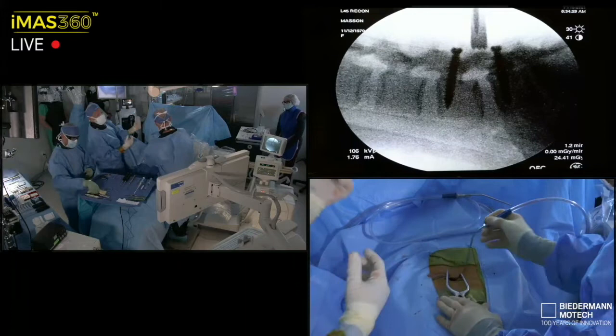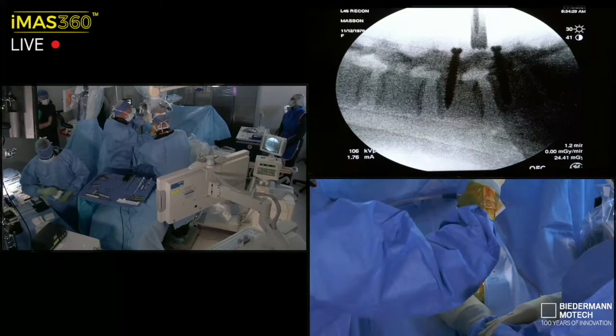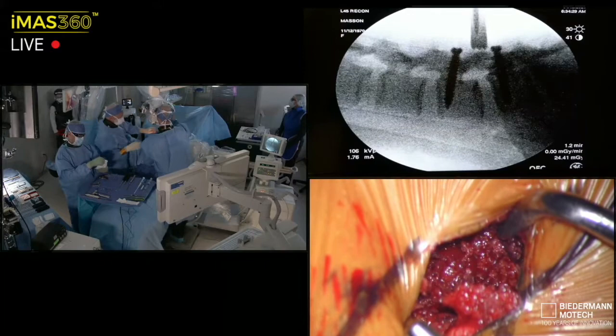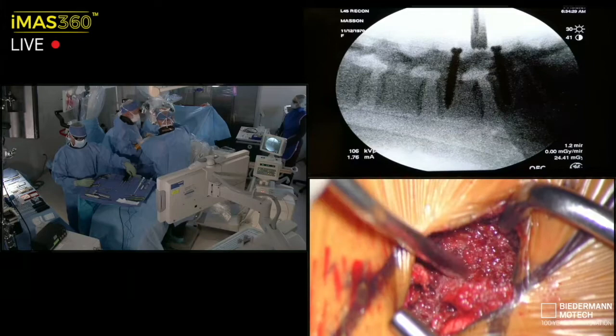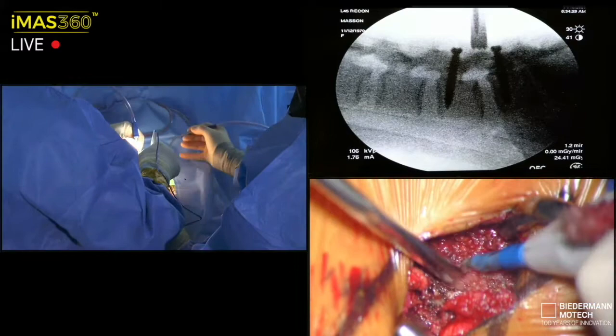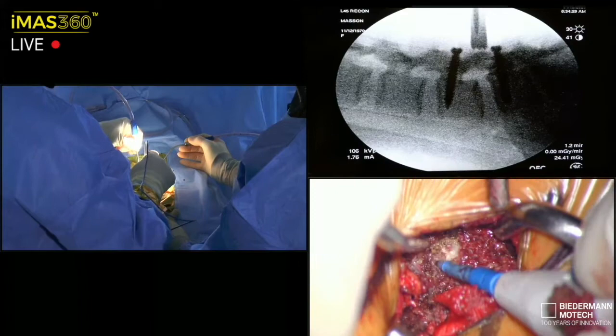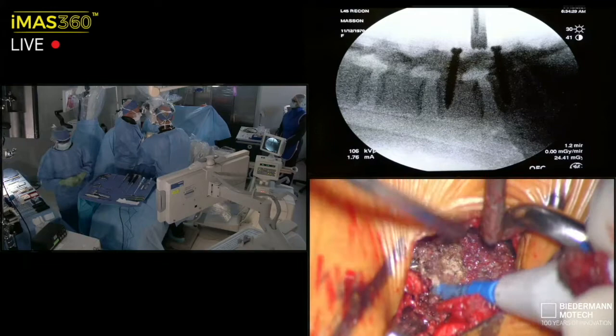I use a Williams microdisc retractor. It's simple, it's easy. Obviously, tubes are our thing. I come in and out with my retractors quite a bit from the different phases, and it's easier to just come in and out with a simple microdisc retractor of any type, depending on how much room you decide you need for adequate pedicle-to-pedicle exposure. At any given moment in time, I'm really managing one pedicle to the next on one side. I have a very specific retraction goal. I don't retract the whole wound at all times. It's very, very deliberate as to where I'm retracting and why.